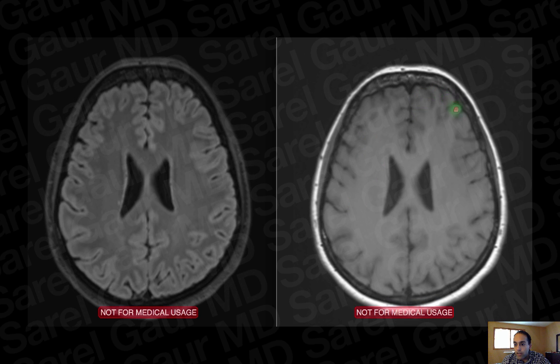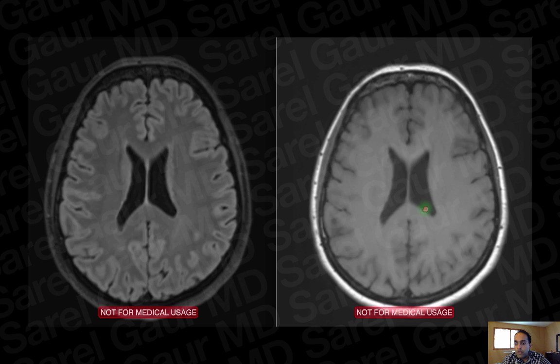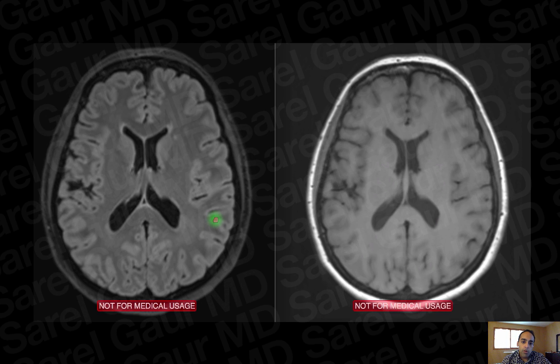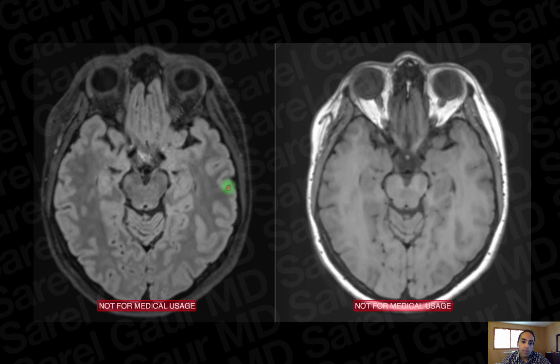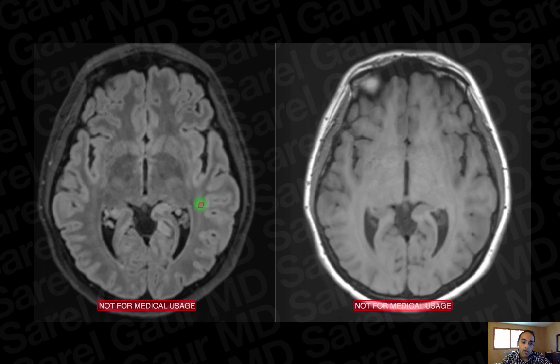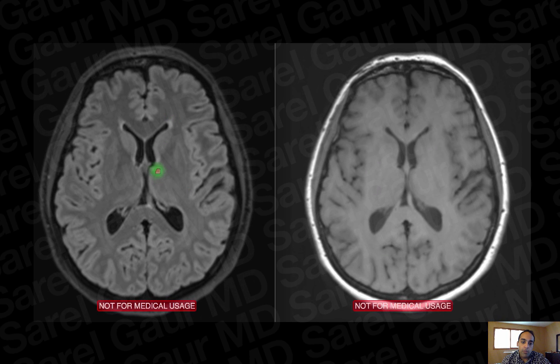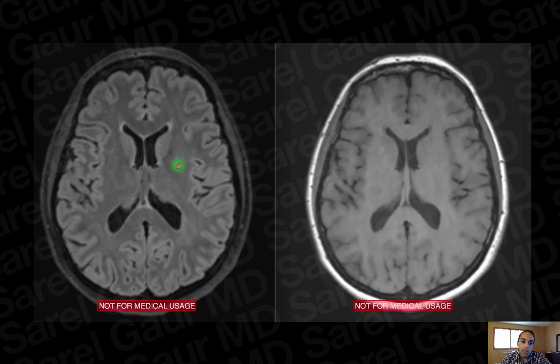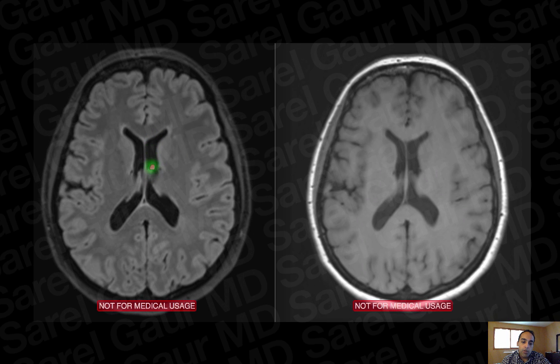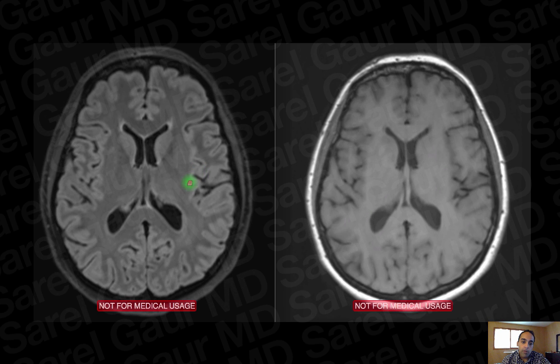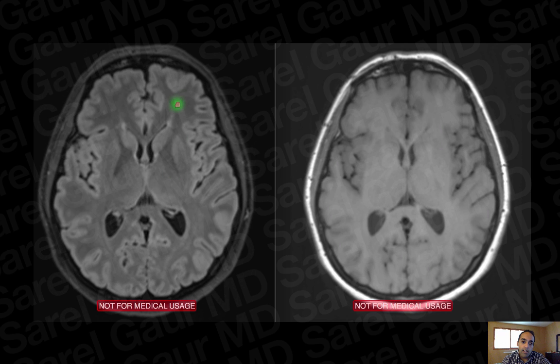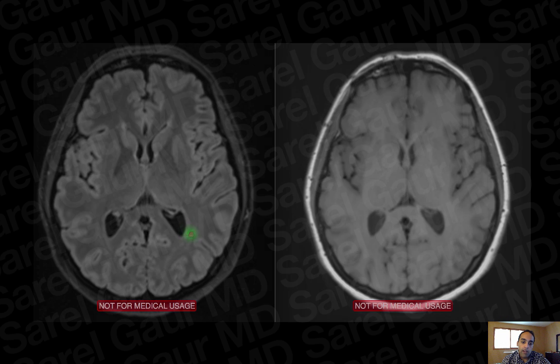On T1, the gray matter is dark and the white matter centrally is brighter in signal. The FLAIR sequence is so important because it allows us to be very sensitive for evaluating fluid abnormality within the brain. Since the brain is bathed in CSF everywhere — in the ventricles and subarachnoid space — FLAIR saturates out the pure CSF signal so that any fluid abnormality becomes more conspicuous against the background.